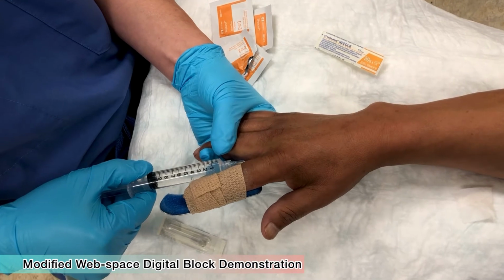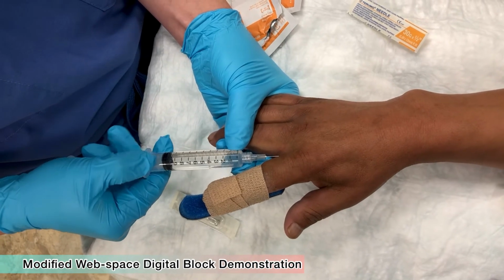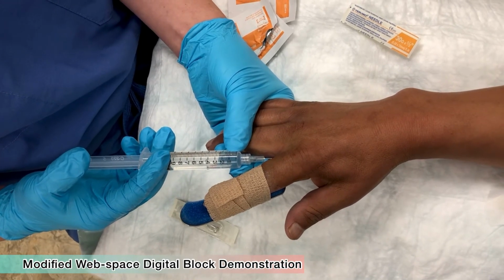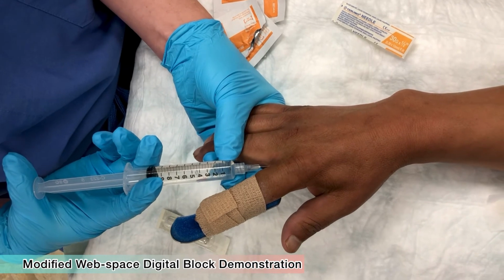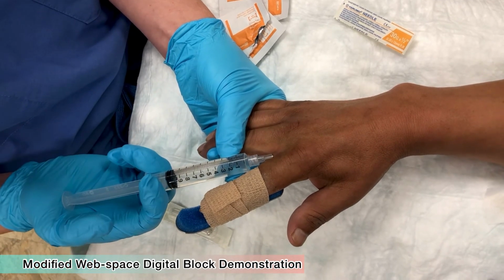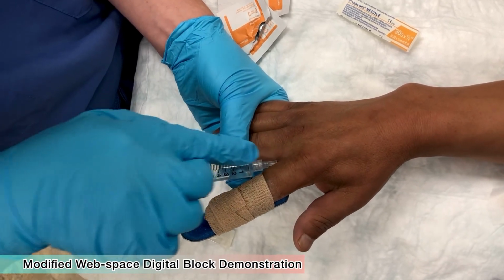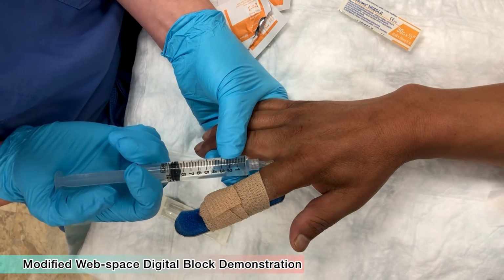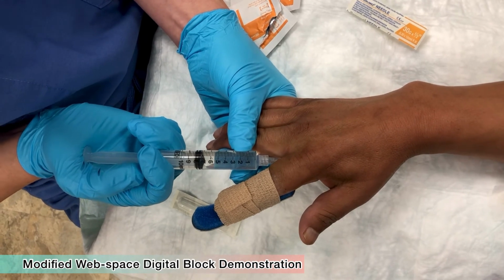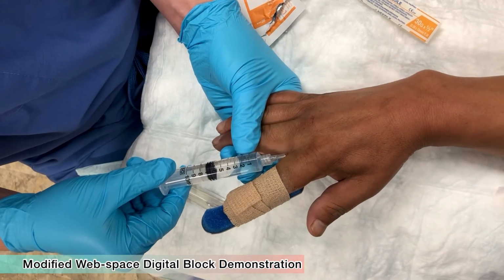So you want to do injections to numb the skin, and then put the needle under the so-called swimmer's ligament. Okay, advance and aspirate. Make sure the needle is not in a blood vessel, and then start injection. The needle angle faces a little bit to the palm side. We inject 3 to 4 cc's and then put the needle back.